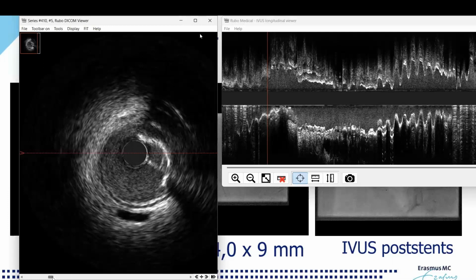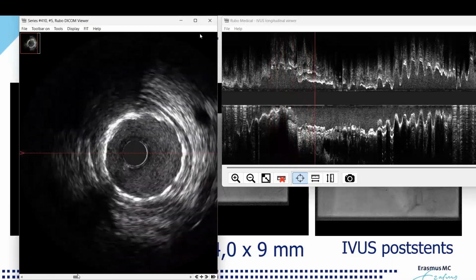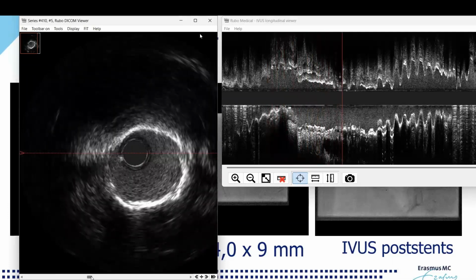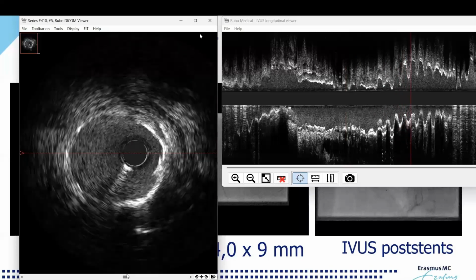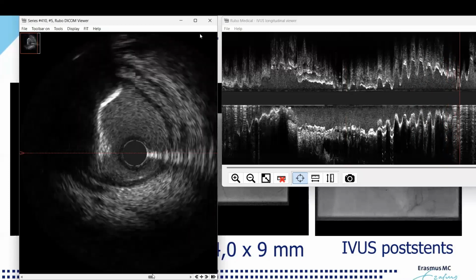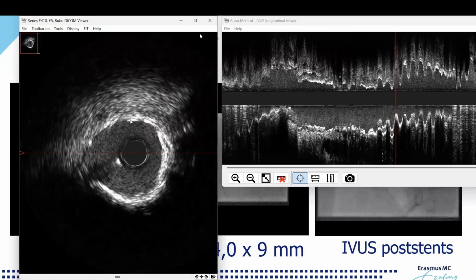We get a sort of carpet design, isn't it, Joost? And here we have the distal stent. You see, nicely circular in here. Yeah, good apposition. Here is some more calcium. And I think that we reached the region where we have the smallest part of the stent. We see overlap with the older stent. Here we're outside already. Let's see. I think that we here, and you see here the overlap of the stent struts.